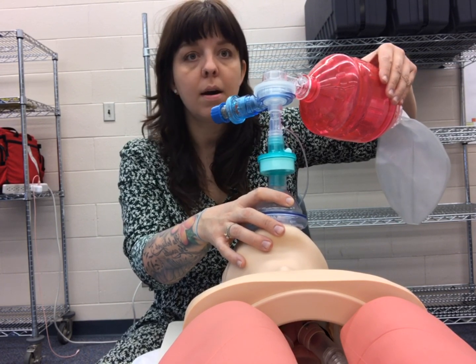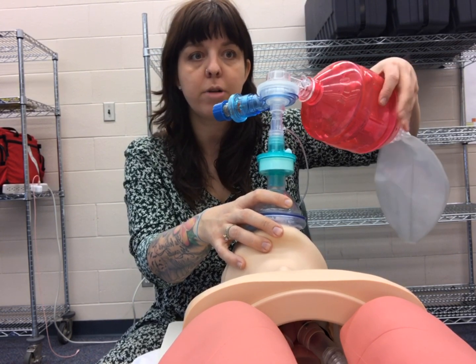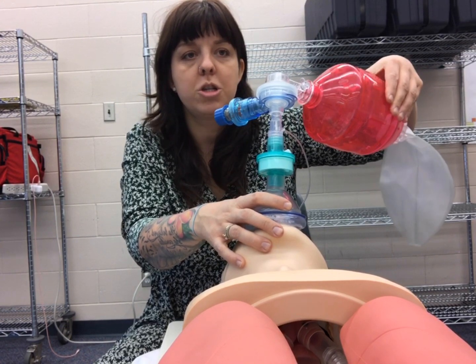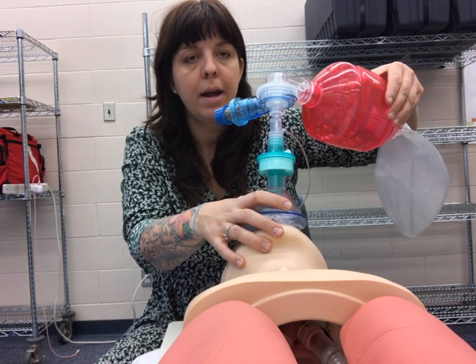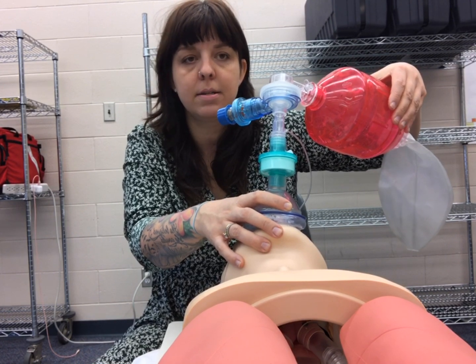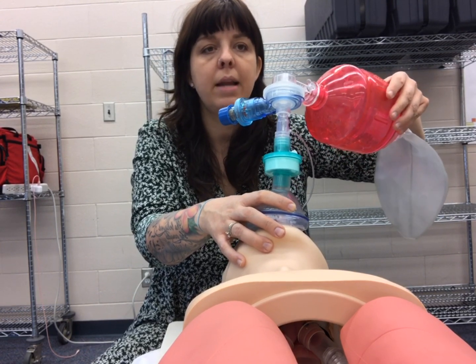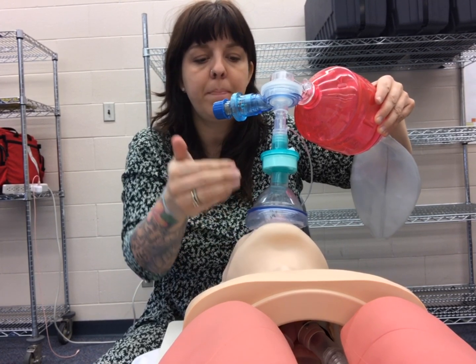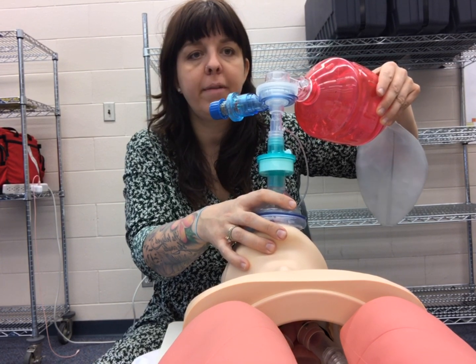With two-person bagging, two NPAs, and an OPA, our sat rises to 85%, then 86%. We're headed in the right direction — our goal is 100% — but it's not climbing higher. After three breaths it's still at 86%. This means we're doing maximum BLS: two-person bagging, two NPAs, OPA, high-flow O2 at 15 liters into the BVM. We can't do much more with these tools, so it's now indicated to insert an advanced airway.